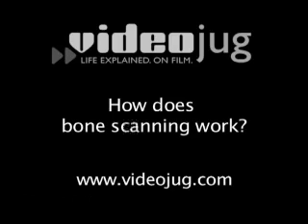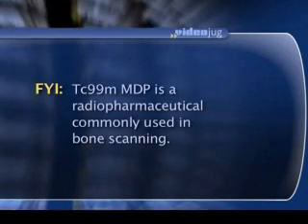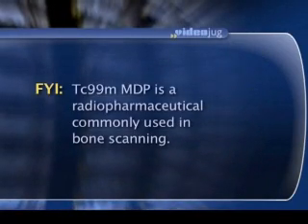How does bone scanning work? Bone scan works through the activity of the radiotracer technetium-99m-MDP, which basically collects at the areas of bone formation, either around tumors, infection sites, or fracture sites. For example, in an area of metastases or tumor, that metastasis is being contained by the normal bone around it. And that bone formational reaction is an area where the MDP goes and attaches itself to. Therefore, it's an indirect way of looking at the tumor.